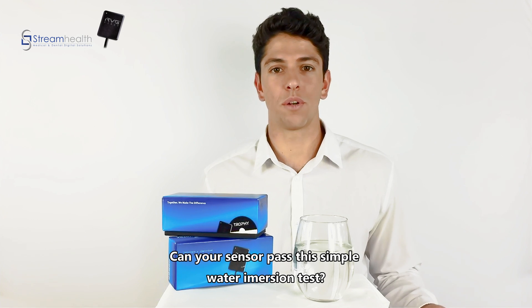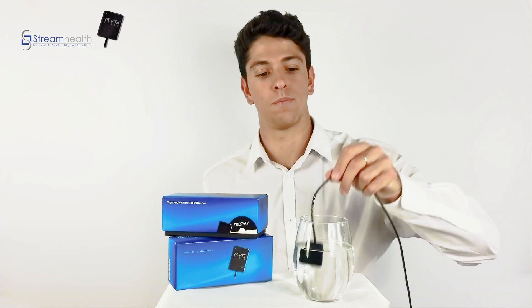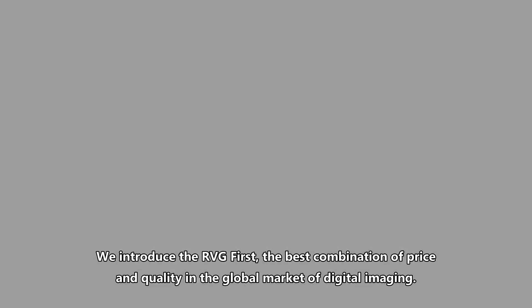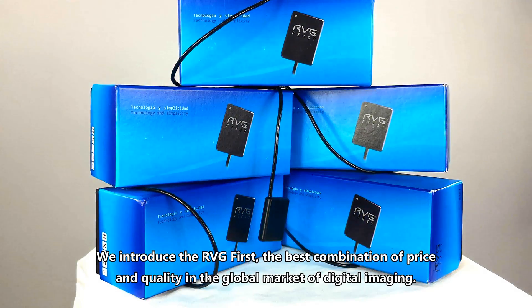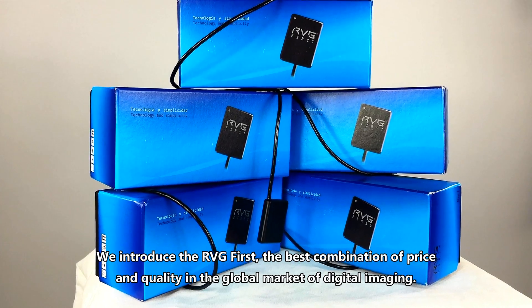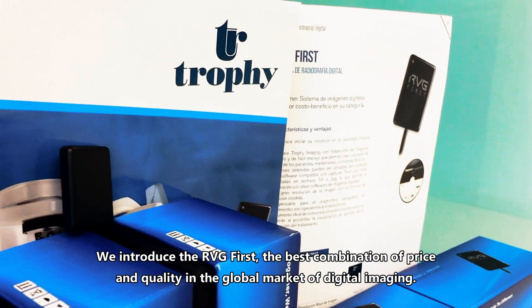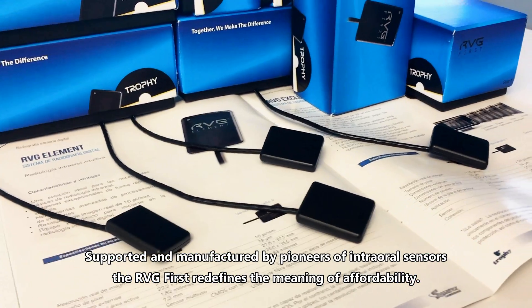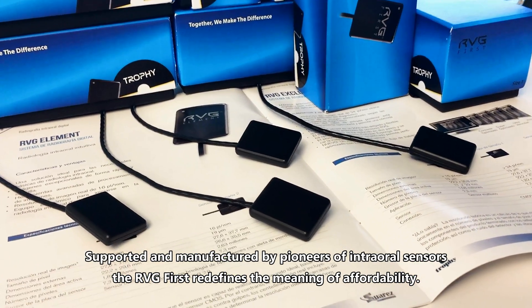Can your sensor pass the simple water immersion test? Most can't. We introduce the RVG First — the best combination of price and quality in the global market of digital imaging, supported and manufactured by pioneers of intraoral sensors.